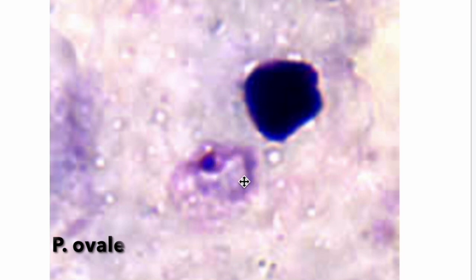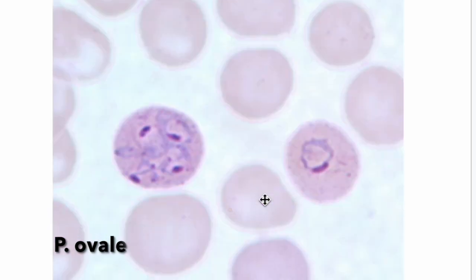But here's your ovale ring form trophozoite, as seen on a thick smear. You can see the thinner cytoplasm and then the chromatin in the center. So a bit more of a close-up. And here's a cell that has multiple ring-formed trophozoites. You can see with the ring form, they do form that shape. One has a lot of rings, whereas the other red blood cell on the screen has just the one. And this one is a thin smear.